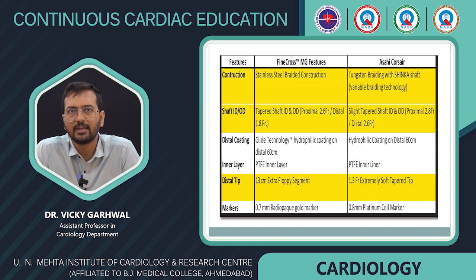So, the difference between the FineCross and Corsair microcatheters. FineCross is made up of stainless steel braided construction, while Corsair is made up of tungsten braiding with a Shinka shaft. Shinka shaft means variable braiding technology. The diameter of FineCross is approximately 2.6 proximally and 1.8 distally, while Corsair has a larger proximal diameter of 2.8 and distal is also around 2.6. Both have an inner layer of PTFE, but FineCross has a 13 centimeter extra floppy segment, and Corsair comes with a 1.3 French extremely soft tapered tip.